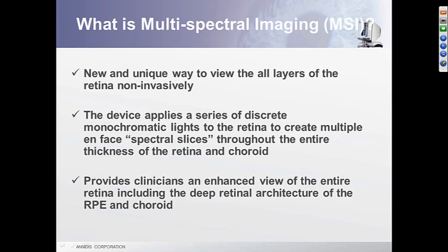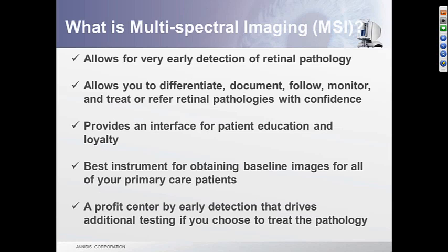So just keep in mind that MSI is really a new way to look at all the layers, or some of the layers, in interaction non-invasively. We know that this works through a series of discrete monochromatic lights applied in sequence to the retina, and the image is then captured. And all of you are now aware that this really provides you with an enhanced view of the retina in a variety of different ways.